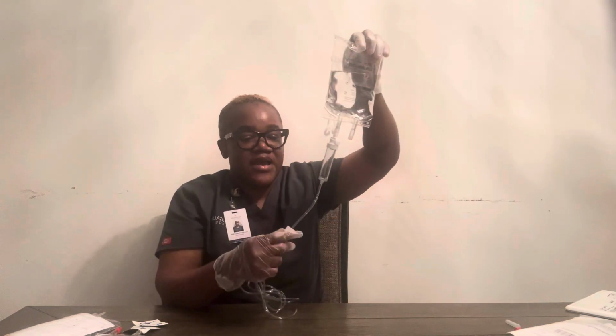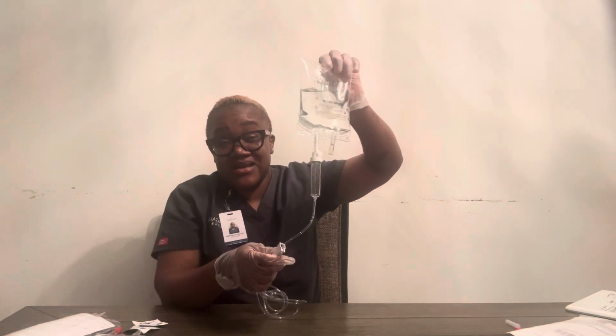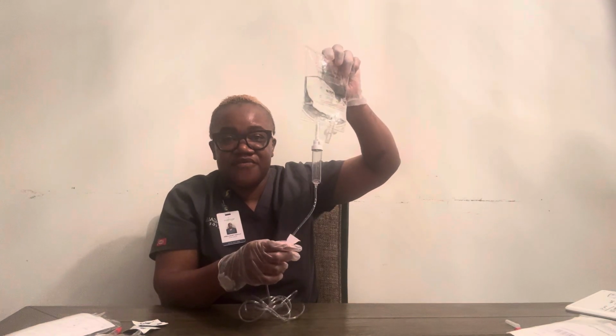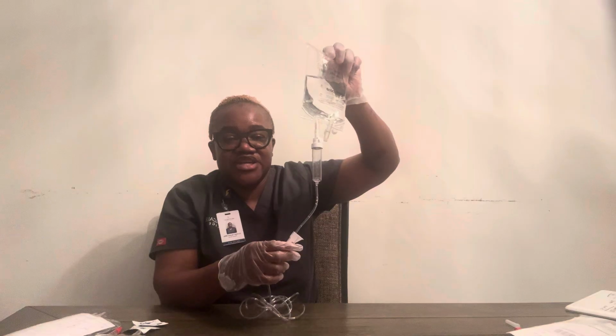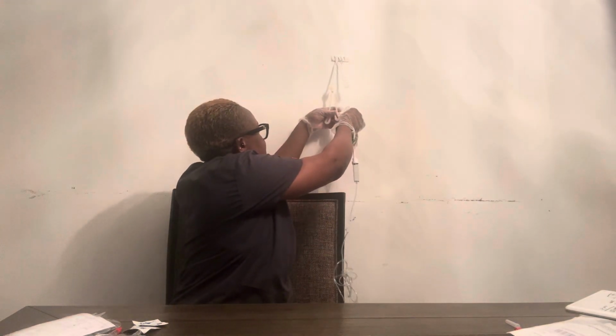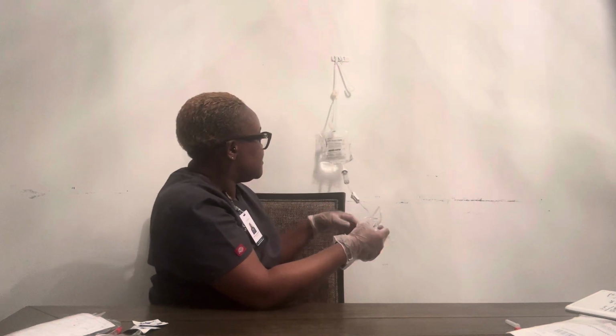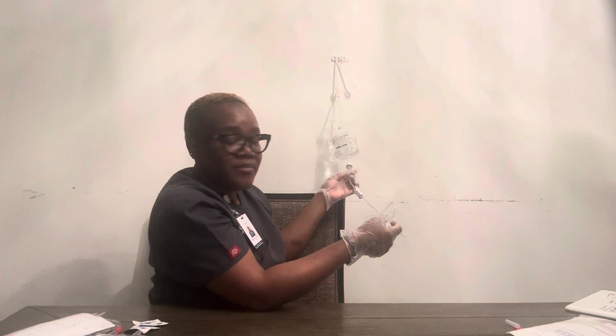Next, I am gonna hang this on my hanger, and because I am also gonna be hanging a piggyback, I have to ensure that this is hung lower, and I have to make sure that it's hung at least 30 inches above the patient's IV site. All right, so now that I have hung this up, I am going to prime my line.